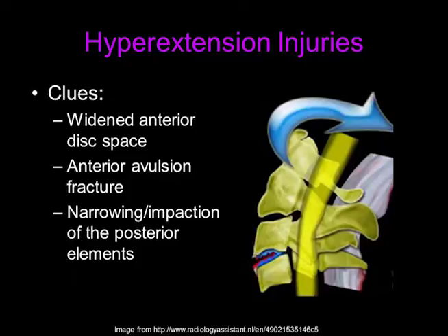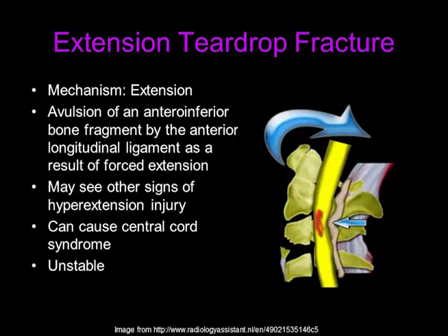Now we'll move on to hyperextension injuries. The clues to a hyperextension injury are widened anterior disc spaces, an anterior avulsion fracture of a vertebral body, and narrowing or impaction of the posterior element. An extension teardrop fracture is a type of unstable injury that occurs with extension. It is an avulsion of the anteroinferior vertebral body by the anterior longitudinal ligament, as a result of forced extension. You may also see other signs of hyperextension injury, and it can cause central cord syndrome.